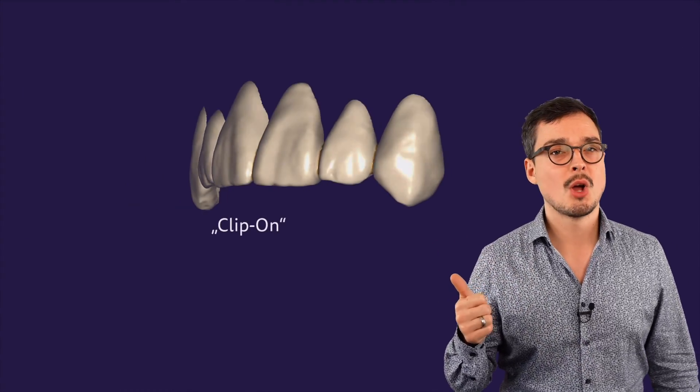First, you can create a clip-on. No prep, no margin, no minimum thickness is required. Just your design, followed by a hard cut to the model.